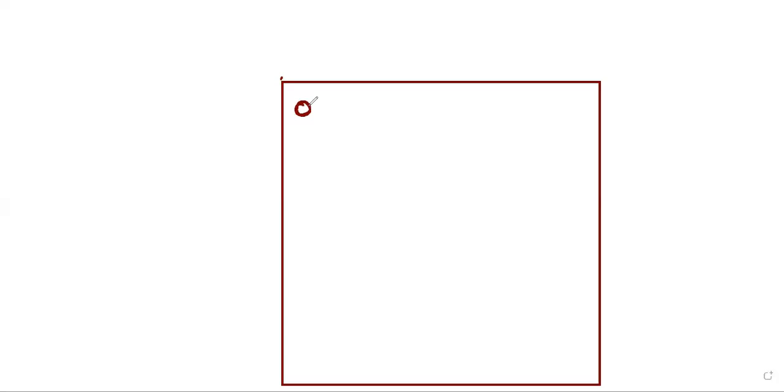So they put maybe patient A. Let's say that they have about 5 patients they are testing, okay? So patient A, patient B, patient C, patient D. So they put their samples here, some sample here, and some sample here. Now, the truth is that each of the hemoglobins, A, C, S, F, and all that, each of them has what? A different speed at which they run.